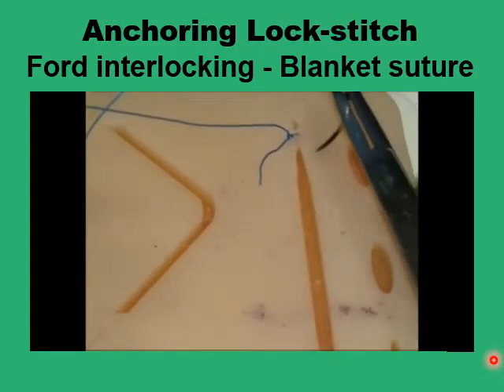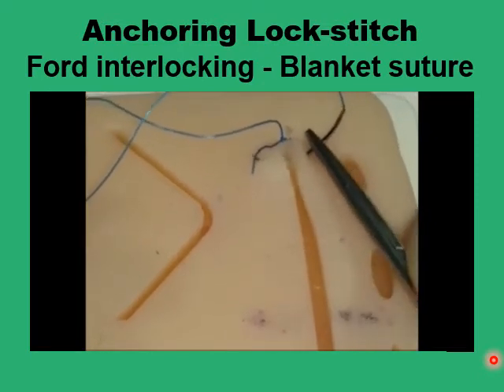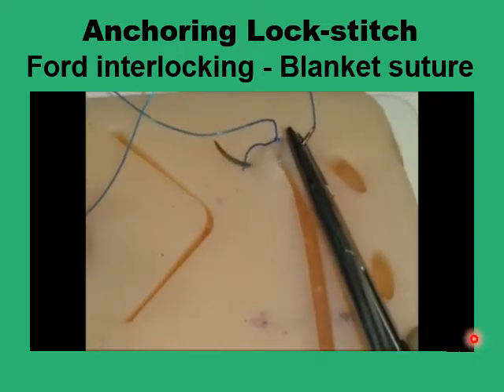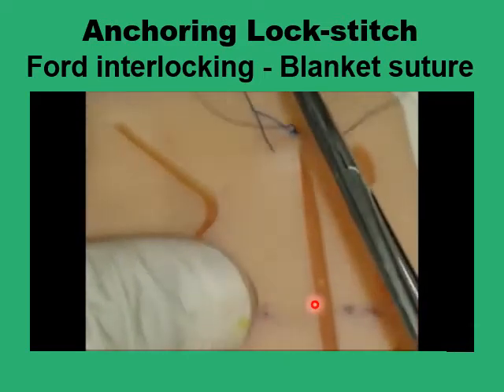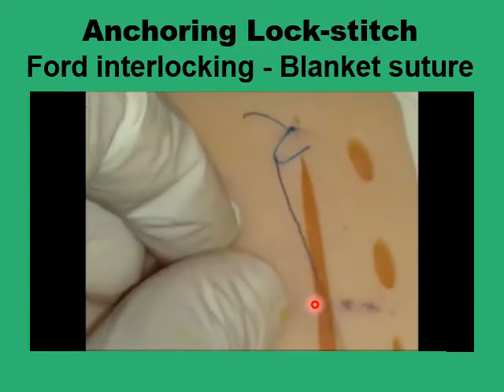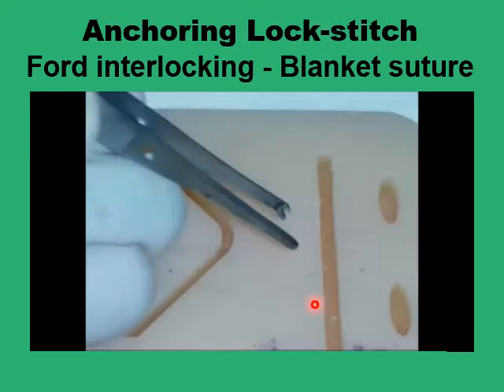Now you go to the next level, again a simple suture, horizontal, but this time you want to pass the needle through the loop of the suture line, through this loop of suture line, and by this you interlock it. And this distributes the tension across the wound line in a better way. So that's the single difference. You get it inside the loop rather than outside the loop as in the simple suture.